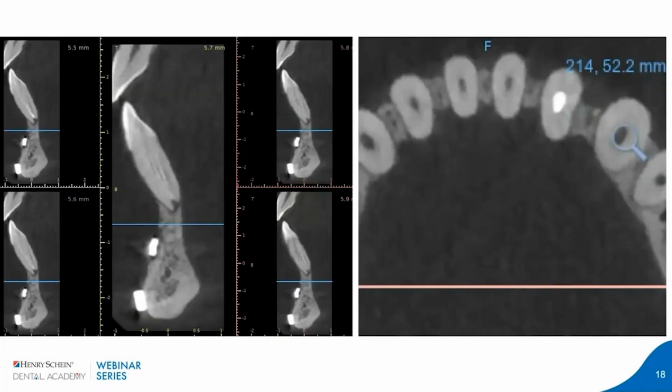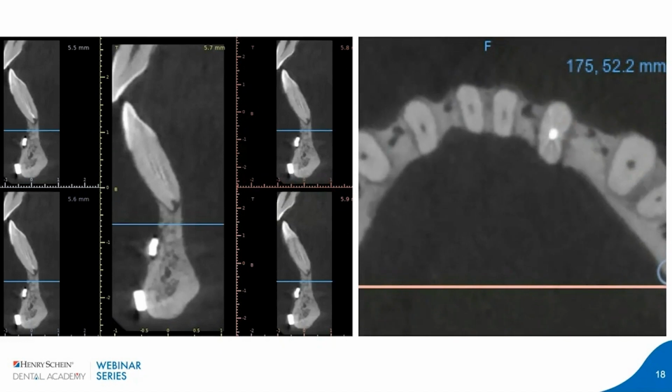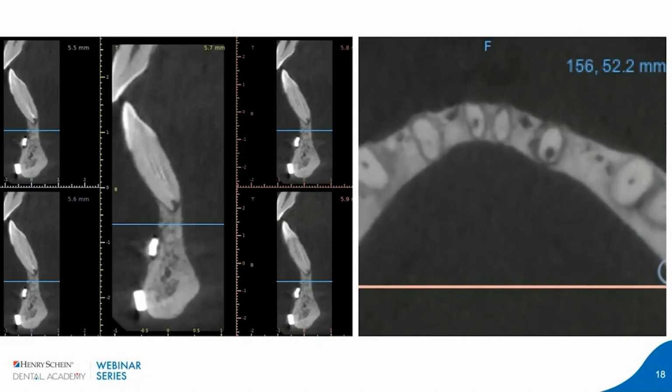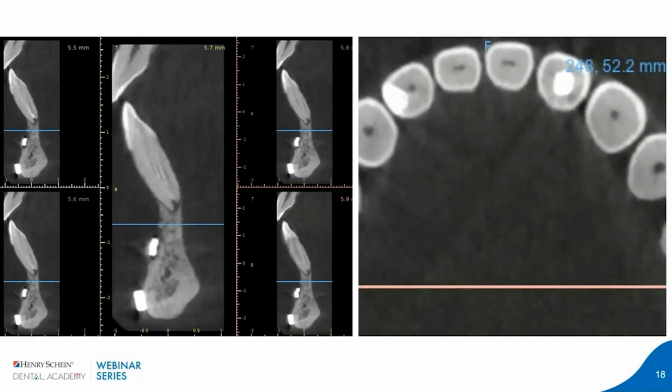So additionally, when we're reading the CBCT, we want to make sure that you're actually reading it properly. Unlike the larger fields of view for surgery, where you're doing full arch or full head, a lot of times the slices will not be centered on a tooth. For endodontics, we want to take the smallest field of view, and then when you actually view the image, you want to be centered on the tooth in question. At the root in question, actually. You often have to center all the axes per root, not just per tooth, so that it's along the long axis of the tooth.